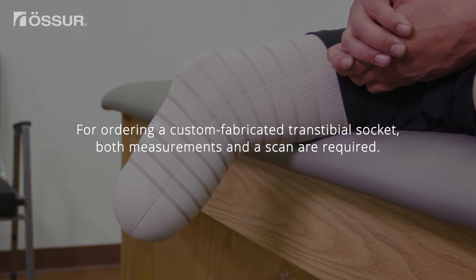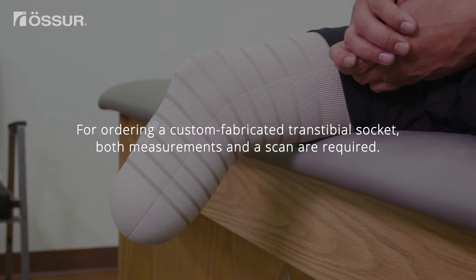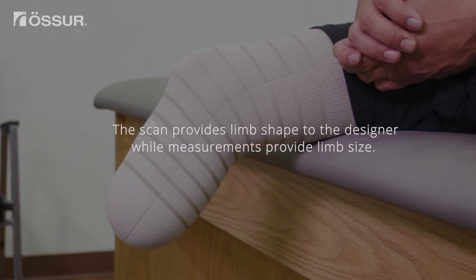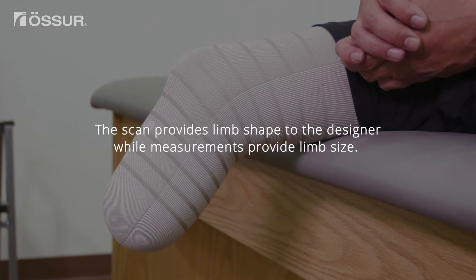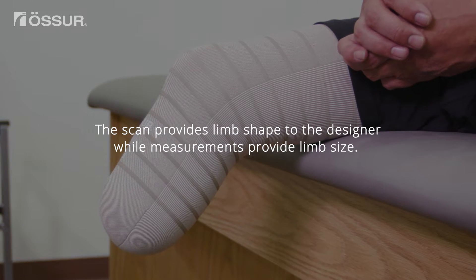For ordering a custom fabricated transtibial socket, both measurements and a scan are required. The scan provides limb shape to the designer while measurements provide limb size.